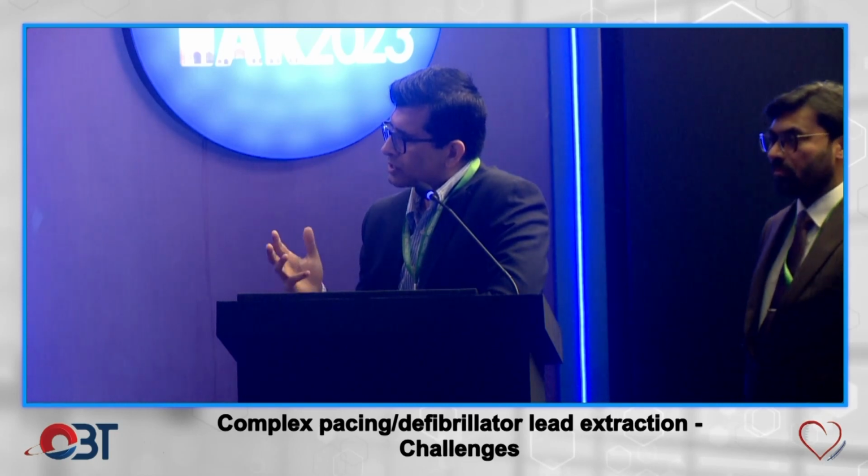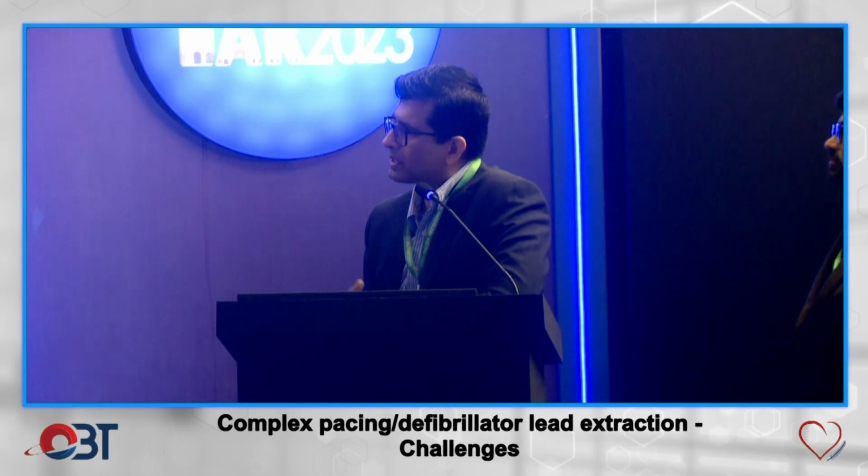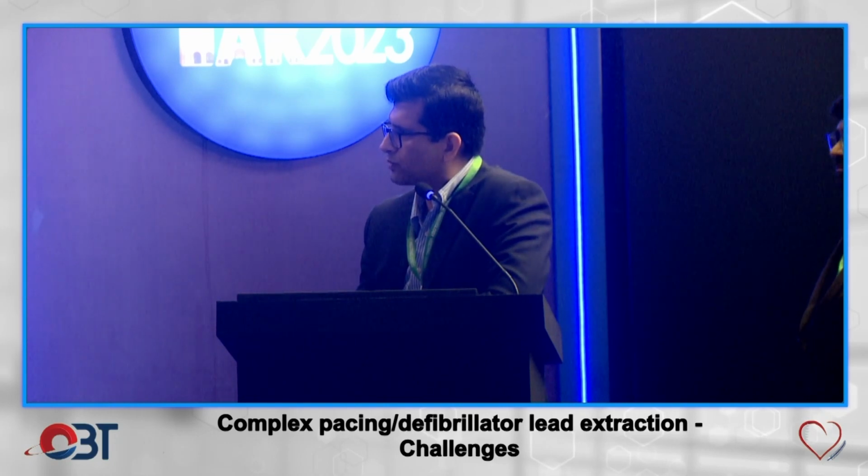And the second part of the question, antibiotics: yes, antibiotics would continue even afterwards. And antibiotics work and perform much better when the lead and the vegetation have been removed, as opposed to a situation where they're already there.